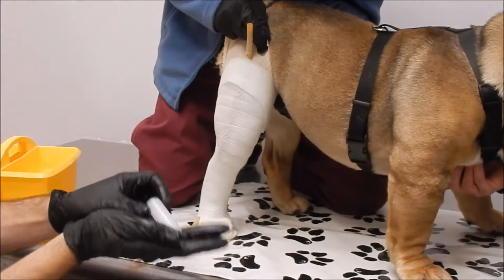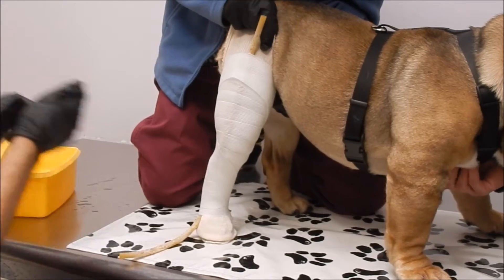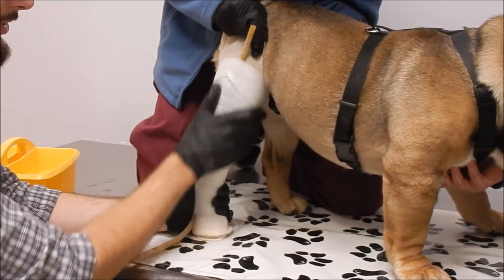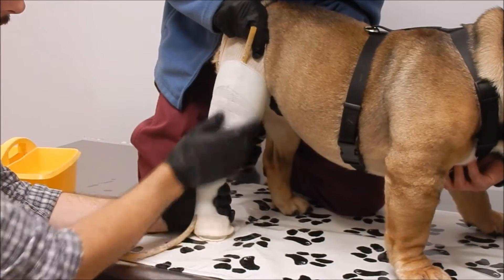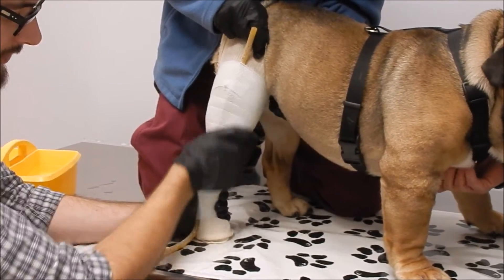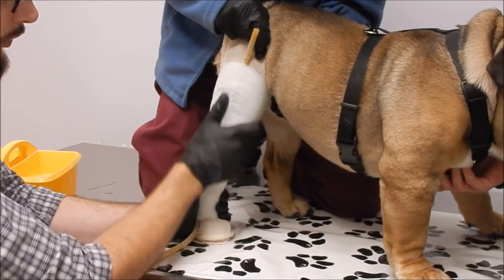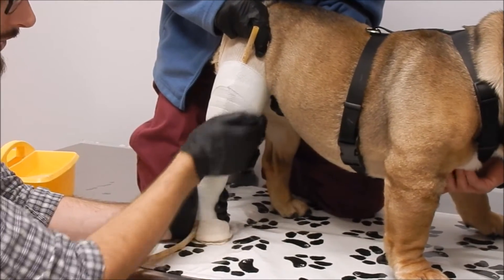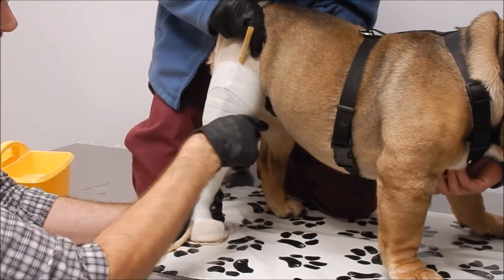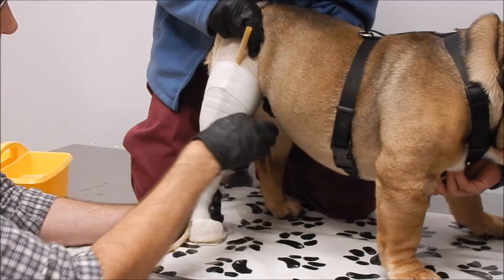So I'm done with my fiberglass. Get a little water on my fingers. Now I want to just kind of give him a little massage, even out any wrinkles, while I'm gently holding his leg in position. We don't want him to put a lot of weight on his leg, but I need to at least simulate how he might stand on it. I'm feeling for my patellar tendon so I can get a little dent there that helps me make the brace.